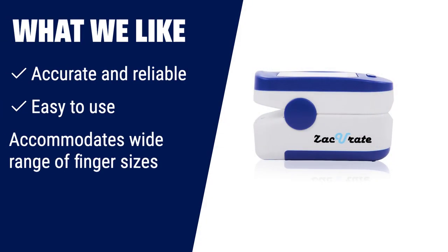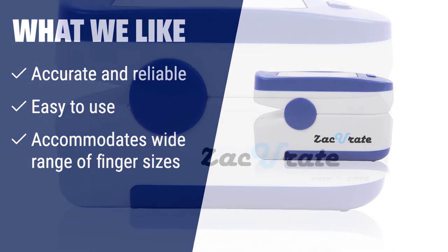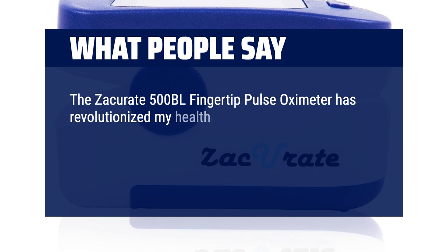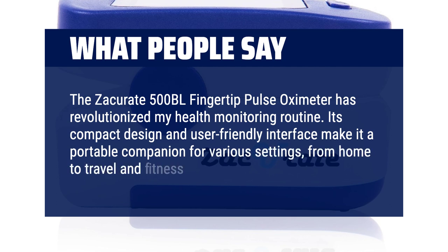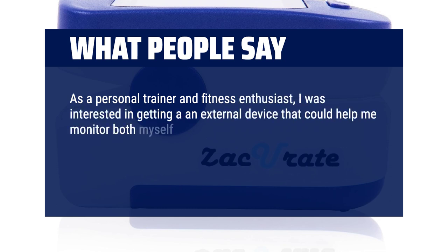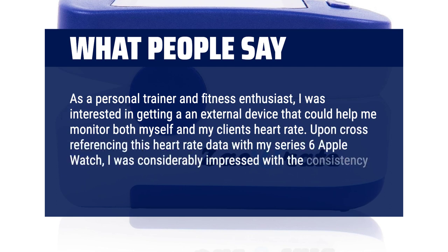What we like: for sports and health enthusiasts looking for a simple and easy-to-use pulse oximeter, the Zaccurate 500BL is the ideal choice. With its accurate readings and user-friendly design, this pulse oximeter makes monitoring your SpO2 and pulse rate a breeze. It also accommodates a wide range of finger sizes, ensuring a comfortable fit for everyone. What people say: The Zaccurate 500BL has revolutionized my health monitoring routine. As a personal trainer, I cross-referenced this heart rate data with my Series 6 Apple Watch and was considerably impressed with the consistency in results.